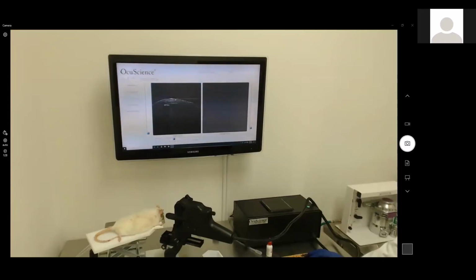Those are available, and we're also wanting to make those types of analysis available for animals, because the Zeiss glaucoma software may not necessarily be a good fit for trying to do glaucoma in an animal model. So what we are trying to do is build a core base of data, and then start building out the analysis from people like you online, to give us feedback.